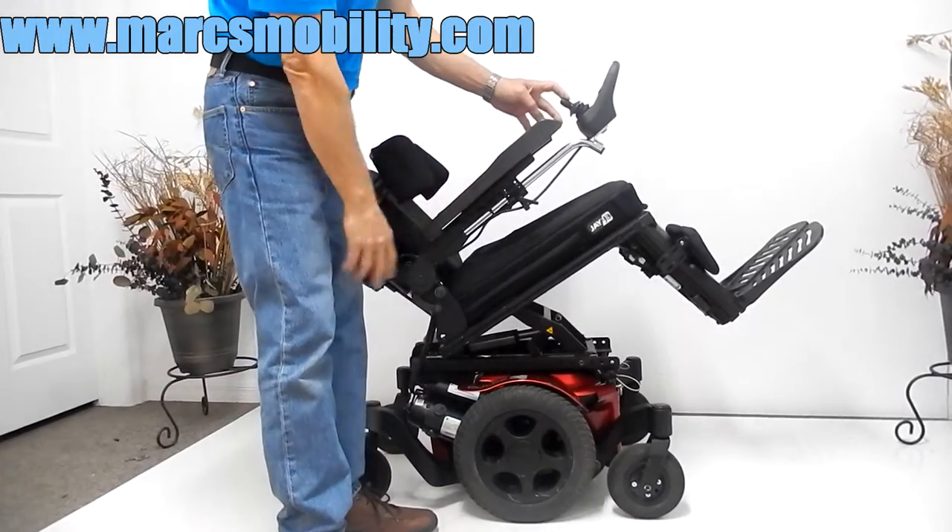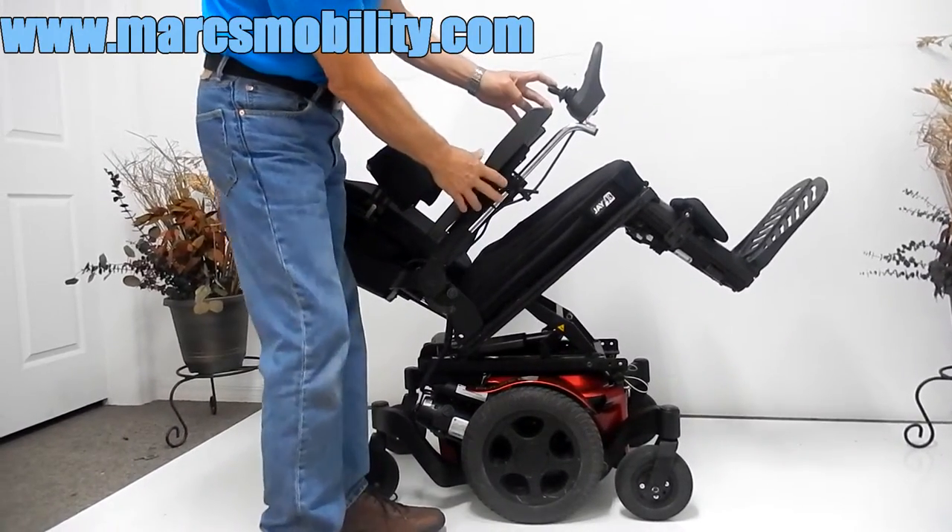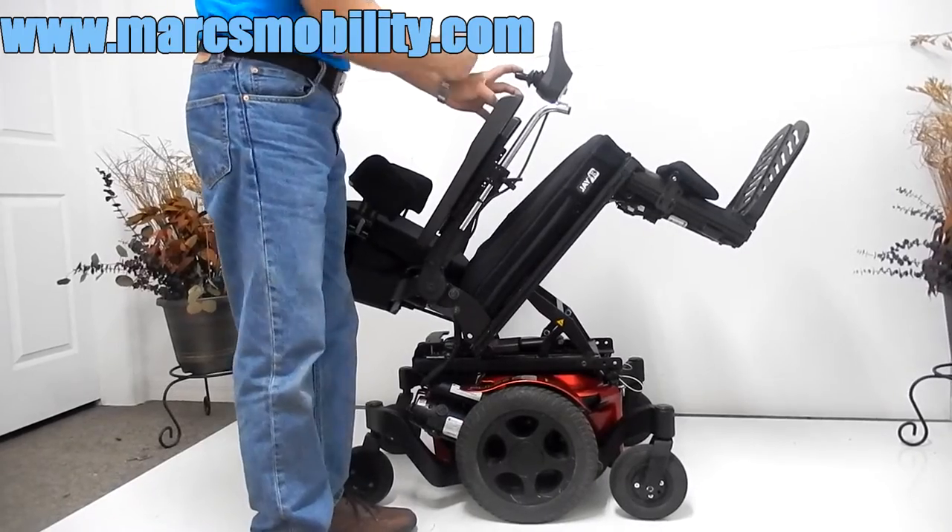This chair has nice long arms. The joystick can be put on the right, or we can transfer it to the left — that's no problem at all for us to do.